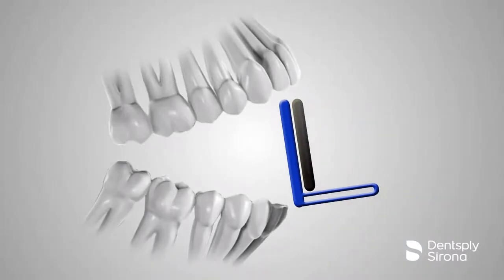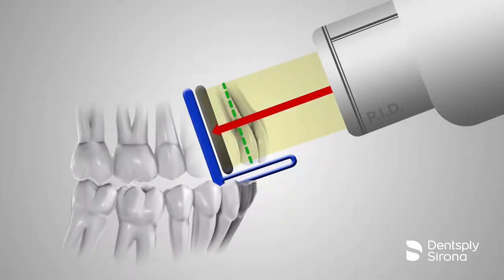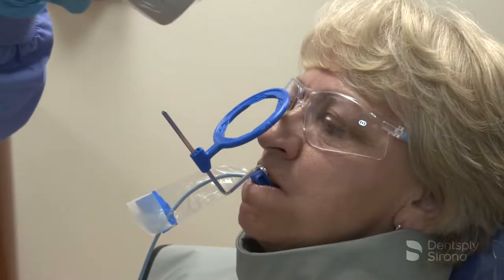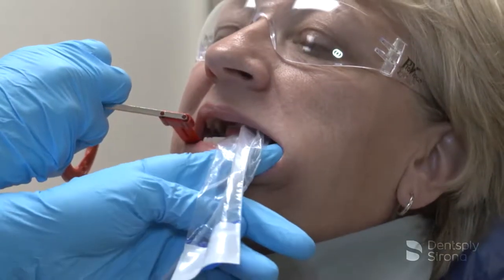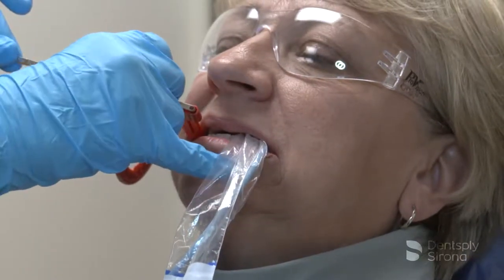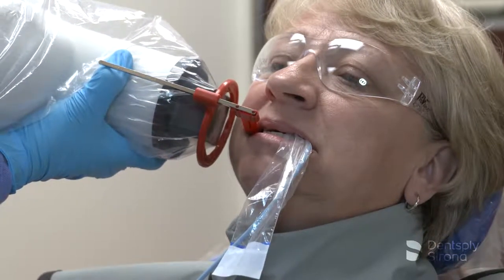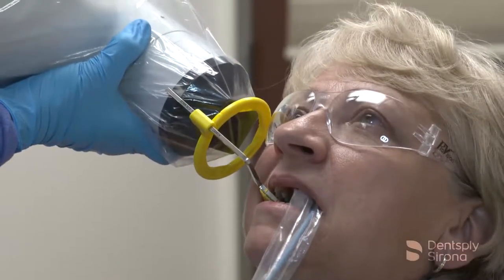The paralleling technique is used for both periapical and bitewing radiographs and is the most accurate technique for taking these projections. Receptor instruments with x-ray beam ring guides improve the accuracy of the PID alignment to ensure correct beam angulation and centering. Receptor instruments combine a receptor holder with an arm that has an attached ring indicating the position for the PID. This helps the operator avoid cone-cut errors by specifically directing the x-ray beam toward the center of the receptor.